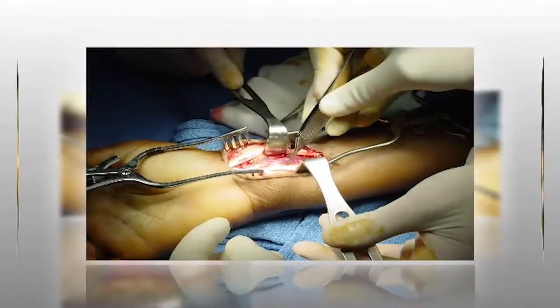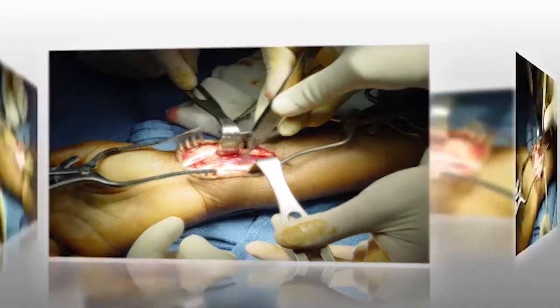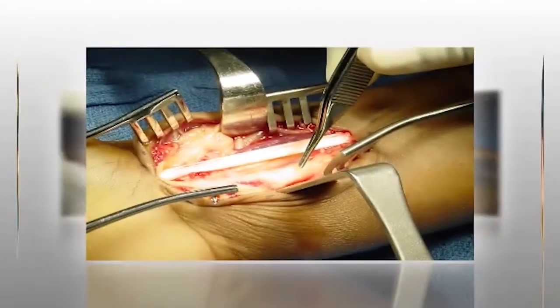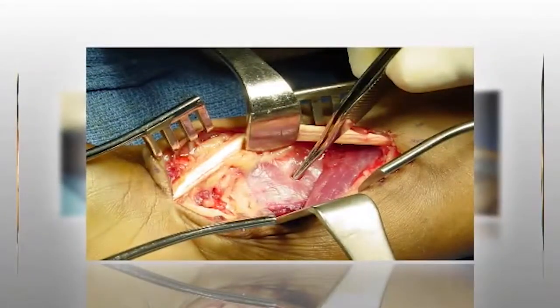The flexor pollicis longus is identified by passive flexion extension of the thumb interphalangeal joint and is retracted ulnarly to protect the median nerve. Next, the pronator quadratus is identified by its transverse fibers and is released radial to ulnar to expose the fracture site. The brachioradialis may need to be released from its insertion on the radial styloid to facilitate reduction and visualization of the fracture. Once the fracture is reduced, provisional stability can be achieved and evaluated under fluoroscopy.